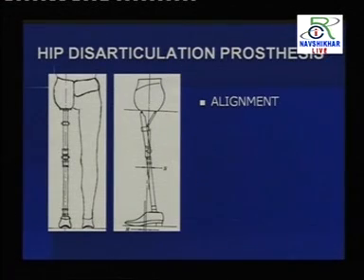This is the level of amputation where you need an external support like a stick, or the patient may need a crutch. So that is essential in this case. You have to advise the patient to take a stick compulsorily. Otherwise there are chances of falling down if the patient is not confident.